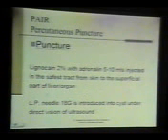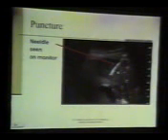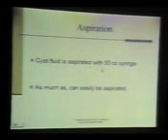From skin to the superficial part of the liver or organ, an LP needle of 18 gauge is introduced into the cyst under direct vision of the ultrasound. Cyst fluid is aspirated with a 50 cc syringe, and as much as can easily be aspirated is aspirated. This is the cyst, and the needle is being introduced and forwarded and aspirated, and gradually the cyst becomes empty.